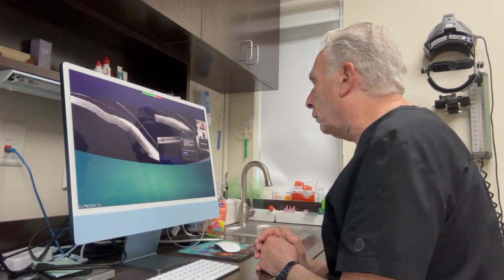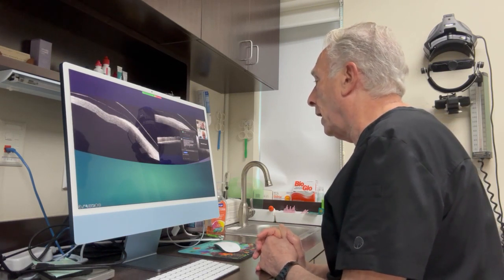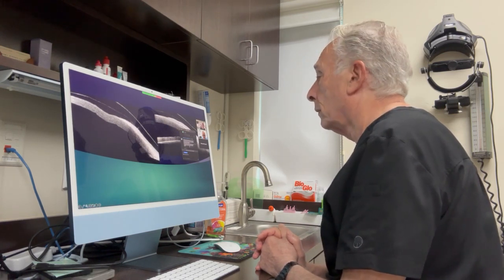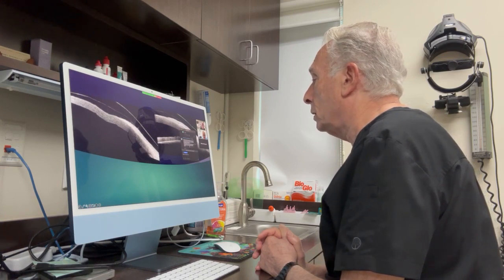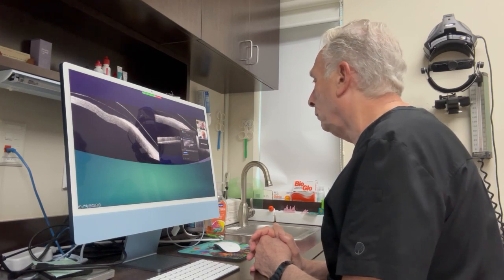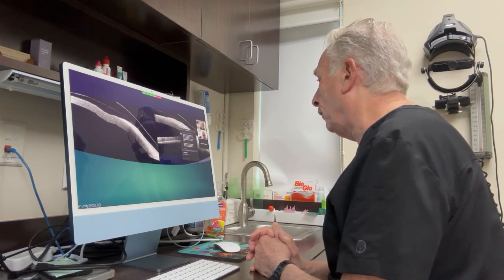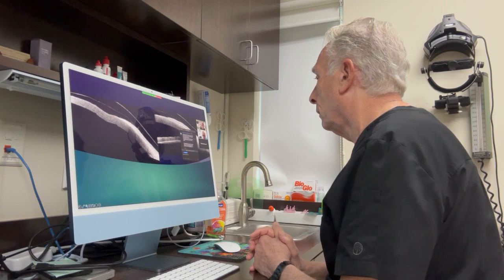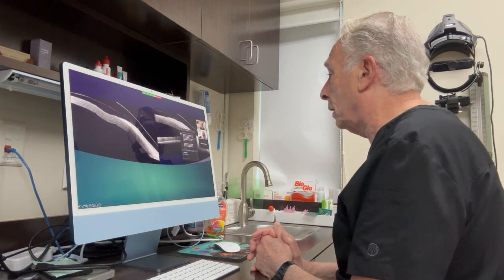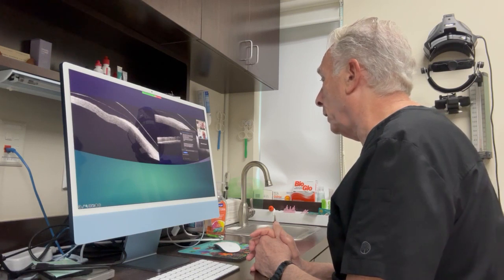As far as central thickness, I don't tell the laboratory about it. I don't measure it, and I don't ask them. Maybe I should, but I don't. It just works out well, so I let them do it. Second question, how many lenses? Rarely one. Sometimes it's two or three. When there are complications, sometimes I may go to three, four, or five. It all depends on the person. I don't know if I'm answering the question. No, everyone's different and unique. Sometimes you get a patient that's really easy, and sometimes someone you want to pull your hair out over.